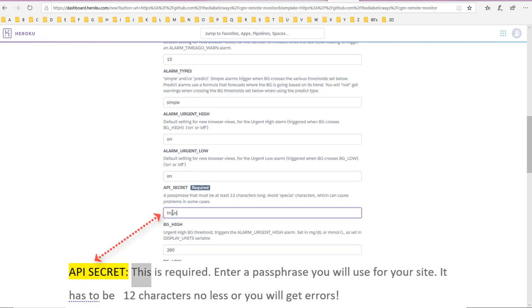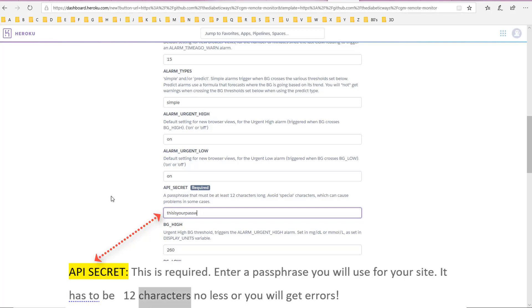API secret: this is required. Enter a passphrase you will use for your site. It has to be 12 characters, no less, or you will get errors.